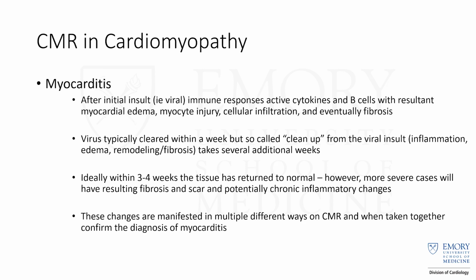Myocarditis. After you have this initial insult from myocarditis, you get a lot of inflammation, edema, myocyte injury, and infiltration in that area. And so that's what you'll see on MRI as well. Eventually, if it's bad enough, you get fibrosis.